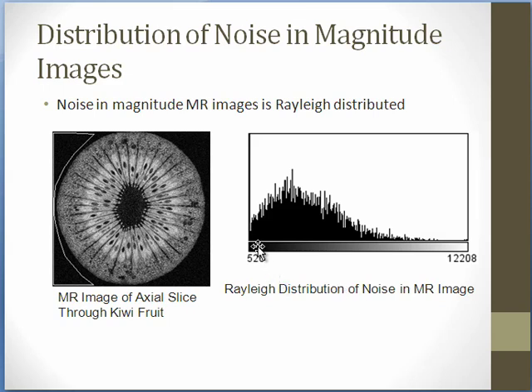So here I'm showing a histogram of the pixels in the white region, part of the noise region, not the entire noise, because obviously there's noise over here as well. But it indicates this distribution. If we had a Gaussian distribution, we would have something like this, going up and down, and a Gaussian would have a zero mean. But here you can see there's a much different distribution.